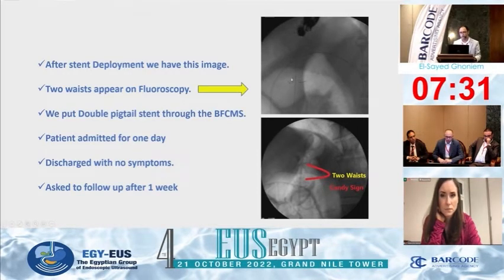And the important thing here is that we didn't miss the wire. The wire, except after you do everything you want to do, the wire is inside the cyst.